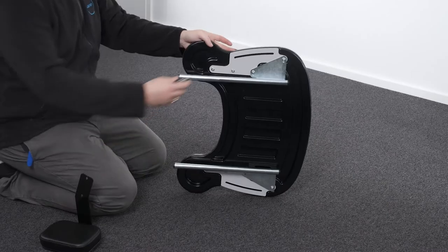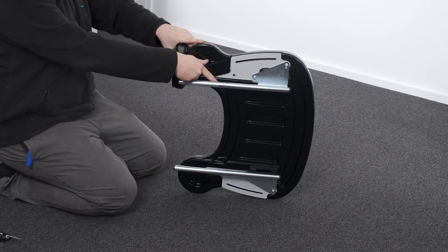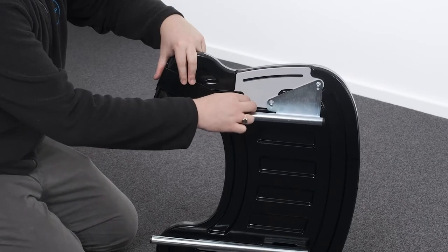Attaching and detaching the elbow blocker. Remove the two washers and bolts. Position the elbow blocker bracket so that the edge of the pad rests on the top surface of the tray and align the holes. Reattach the two bolts and washers and secure using the Allen key.